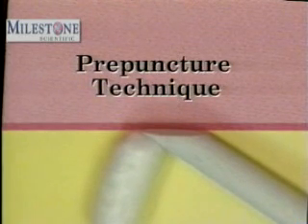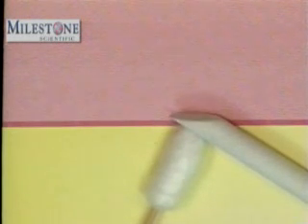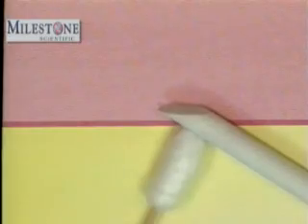Now activate the slow flow rate for approximately 8 to 10 seconds. Listen for the cruise control sound tone at this time. Activating the cruise control function will lock in the slow flow rate for this injection. Continue the slow flow rate and penetrate the surface of the palate very slowly and very gently with a slight rotation. It should take several seconds to reach bone depending upon the tissue thickness.